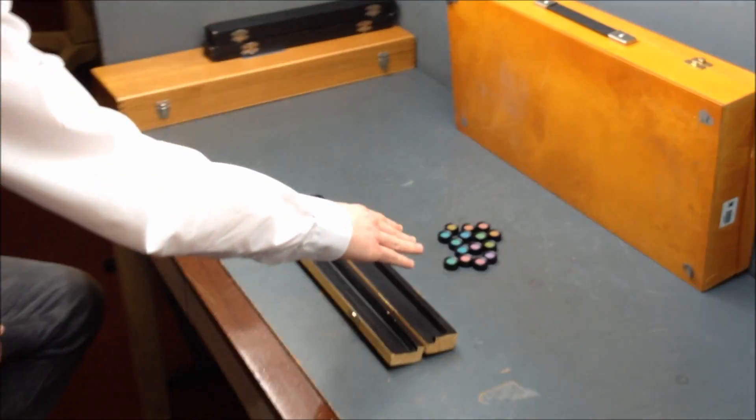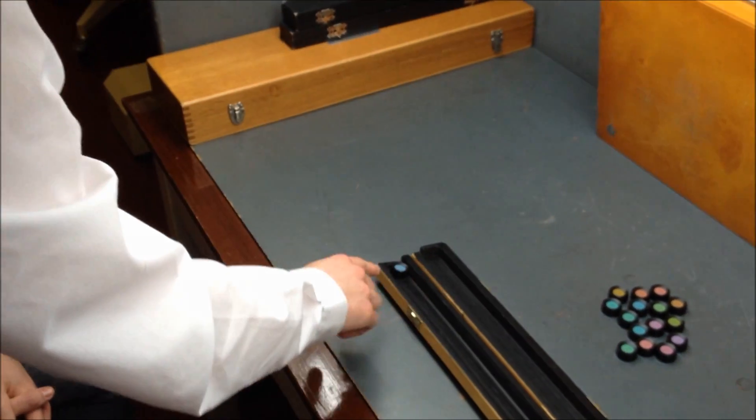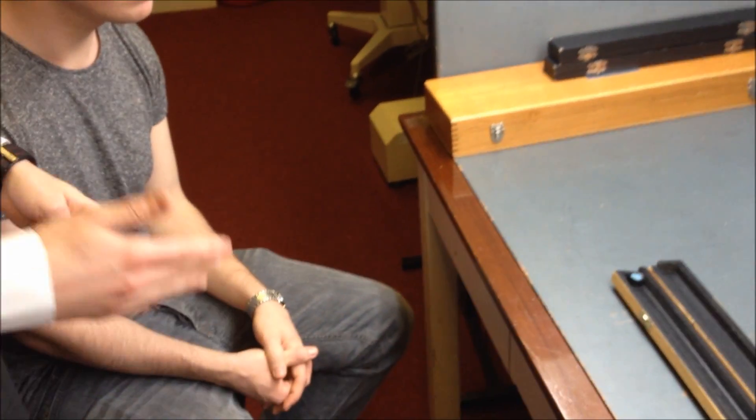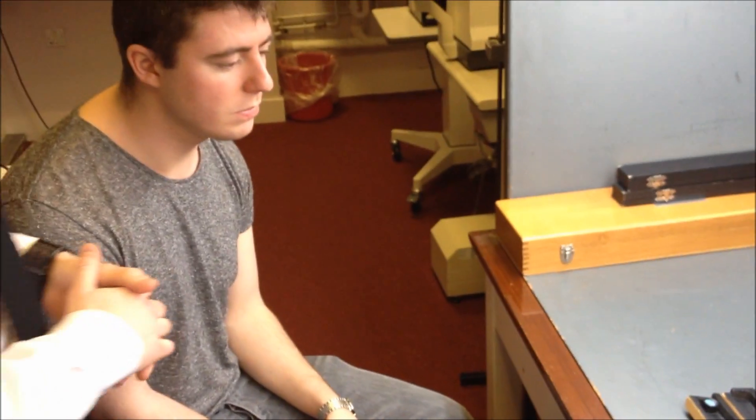So as you can see here all the colors have been mixed up and what I'm going to ask Thomas to do is pick the color from here which you find resembles that one the most and we'll do this until the line is complete. And hopefully this will resemble the sequence we've seen before. So I'll ask Thomas to do that now.